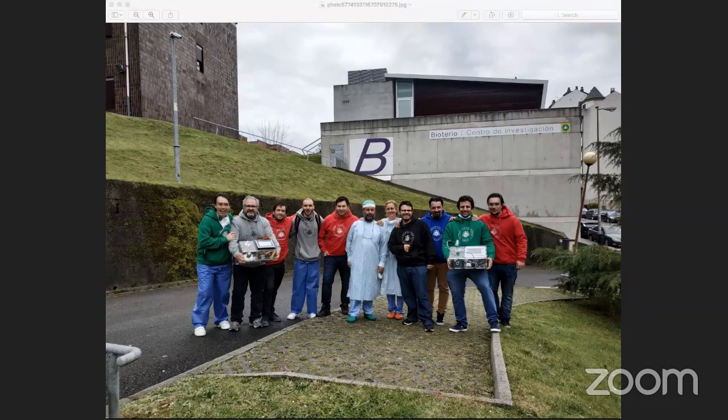As David said before, in this journey it was very difficult to work remotely, having our only prototype in place in Oviedo, and collaborating from different places in Spain. But some of us were able to join the crew here. About ventilators, a lot of people are working on ventilators. That's great. But we focused on a ventilator especially designed for the most critical COVID patients that includes PEEP and triggering functions.